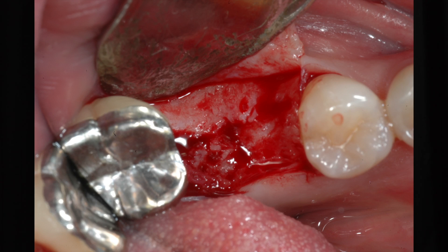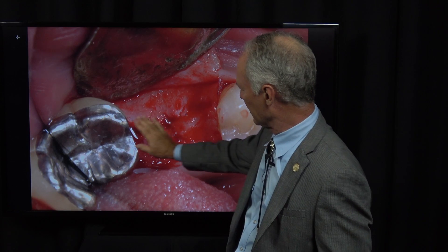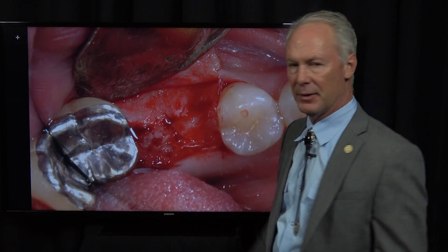Look at this photograph after I've uncovered the ridge. This is where the tooth was extracted, and look at that — it's just perfectly flat after six months of healing, and that bone is dense, natural bone.